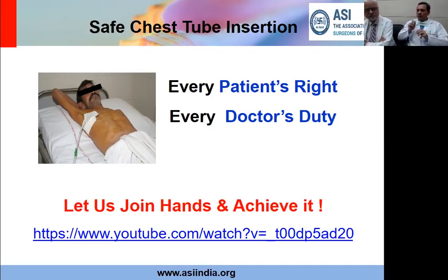But guiding is important, because if you just insert it, say this is the body of the patient and this is the hole, and I insert like this and then put the tube, it will have a tendency to go towards the apex. So when I'm holding the tube, the initial entry should be in that direction, like that, and then you put the chest tube so that it goes in that direction. Try to visualize the tube lying in the posterior diaphragmatic recess. If you get your tube there, it will function in the best possible way.